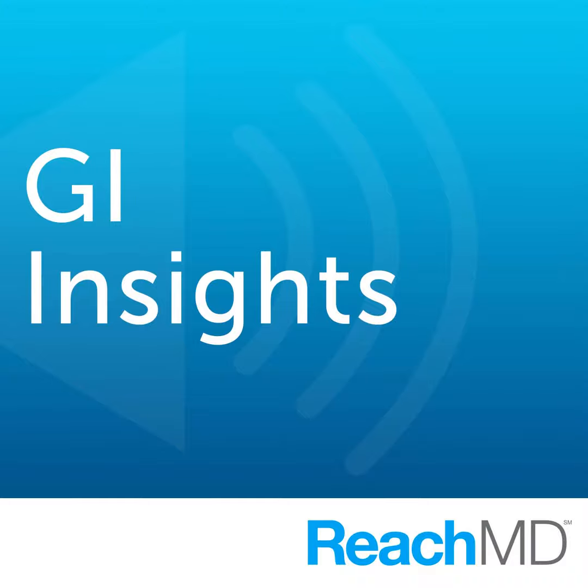So let's start with the use of fluoroscopy. We have left the use of fluoroscopy to individual endoscopists. It just depends. There are some individuals who've been doing dilation for years now. They feel very comfortable. However, if you're early in career, just out of fellowship, and you're starting to deal with strictures and you feel more comfortable, sure, use the fluoroscopy. I also want to point out that we describe dilations mainly in two types, antegrade dilation and retrograde dilation.